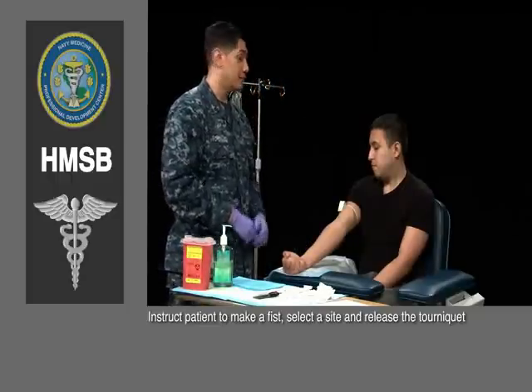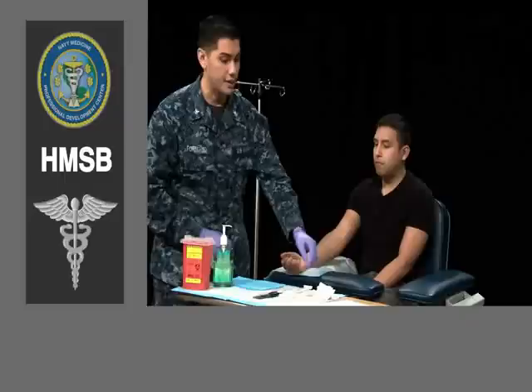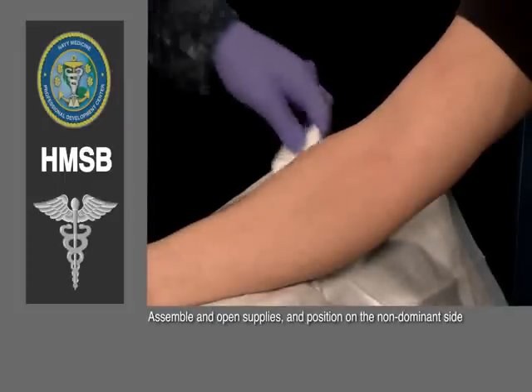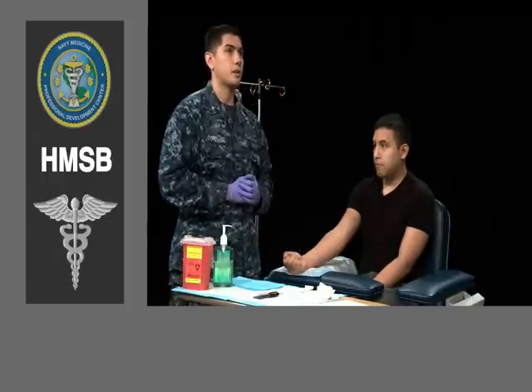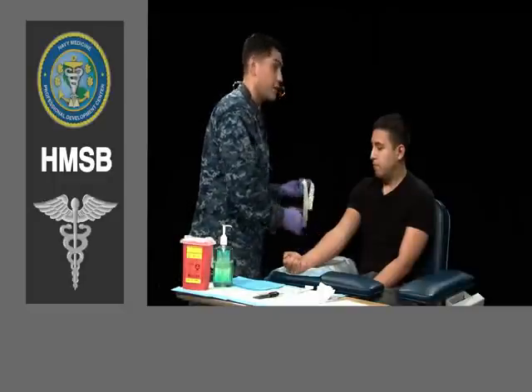Once I've selected the site, I'm going to release the tourniquet and prepare my supplies. Now, I'm ready to reapply the tourniquet and relocate the vein.